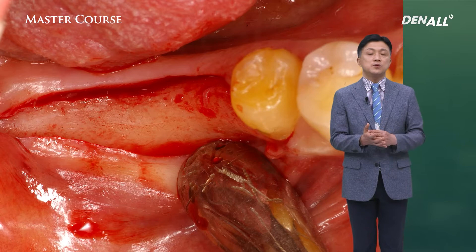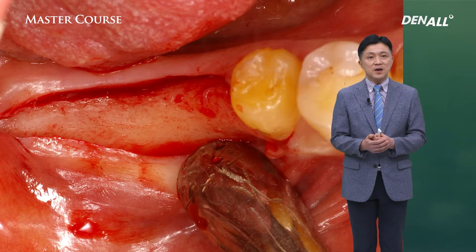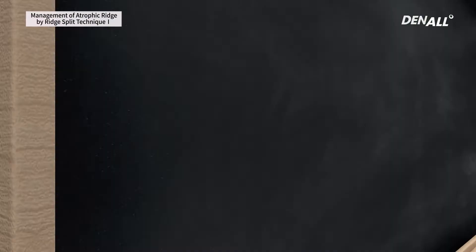If a long time has elapsed since extraction, you can see horizontal resorption, especially in the buccal area. If this worsens, you come across a knife-edge ridge. There are many difficulties in placing an implant in such a thin ridge, and there can be many difficulties in securing long-term stability of the implant.